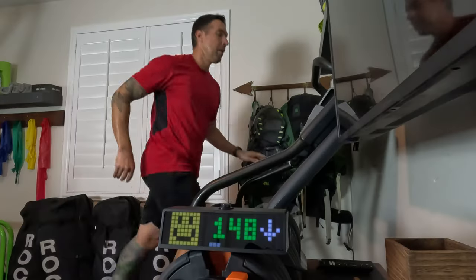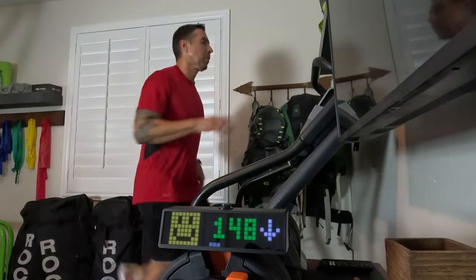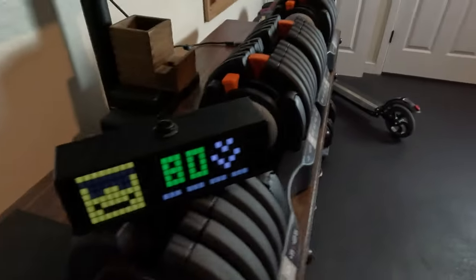Okay, I'm running. I've been running for quite a bit. It's loud in this gym. My glucose is currently reading 80 with the double down arrow. But in my head, I feel worse than that. I'm gonna check real quick and see what Dexcom says. It's reading the same exact thing, 80 with a double down arrow, which leads me to believe that within 5 minutes, that thing is gonna start to go off. You can hear it right now. So here's what it sounds like and here's what it looks like.